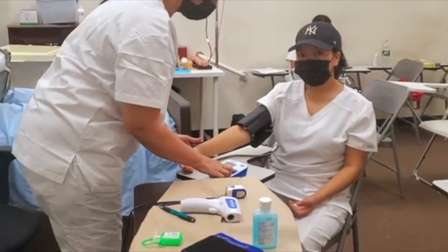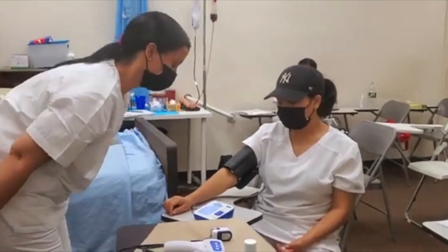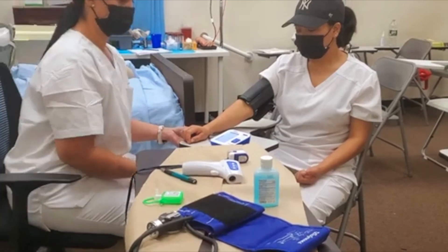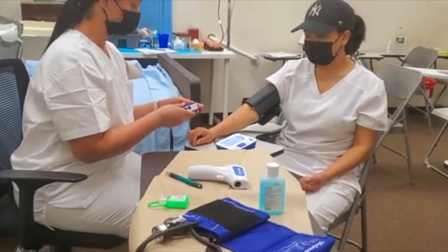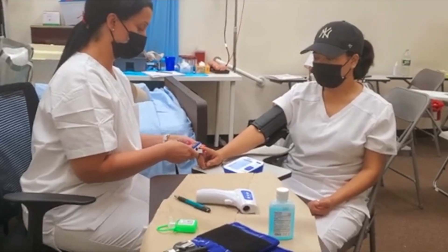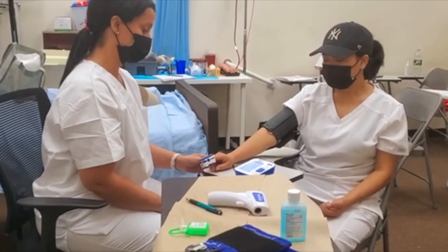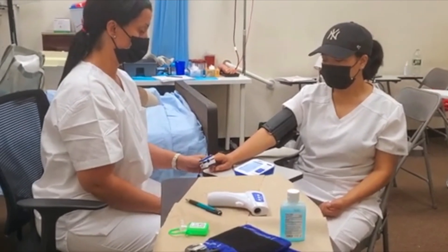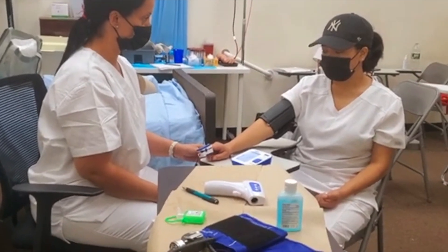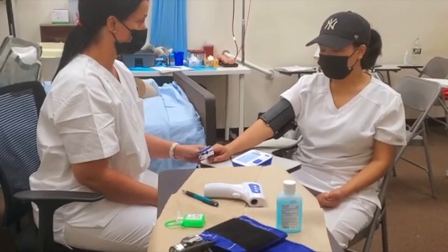So Giselle is using a manual blood pressure, right Giselle? And she also has the pulse oximeter. Now the first blood pressure number is going to be the systolic, and the second blood pressure number is going to be the diastolic.